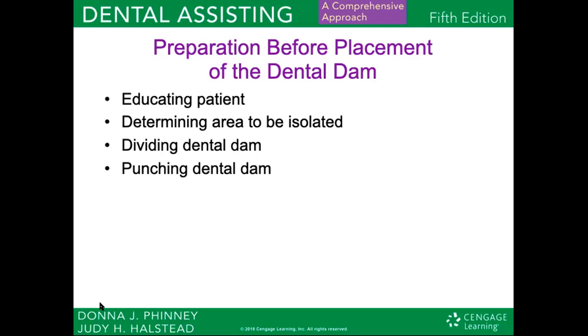So the patient should be told what the dental dam is for and what to expect when the dental dam is placed. The dental assistant trained in advanced functions can prepare and place the dental dam, and the area to be isolated should be determined, and then the dam will be punched, placed, and then held in place.